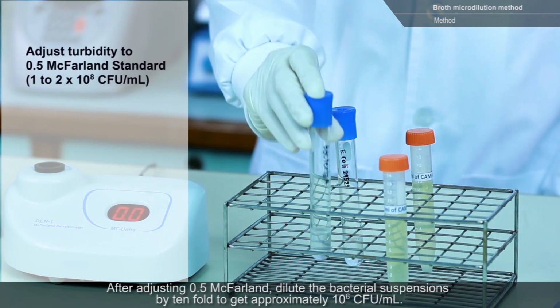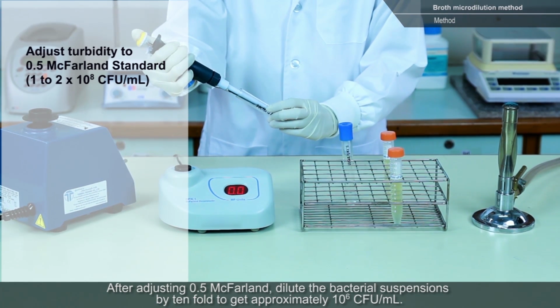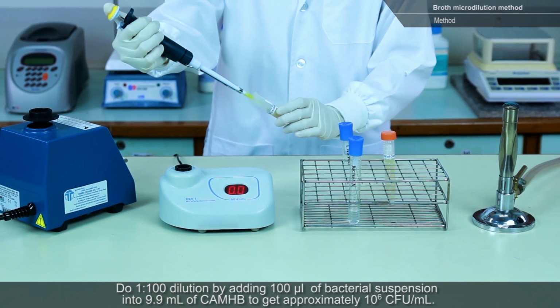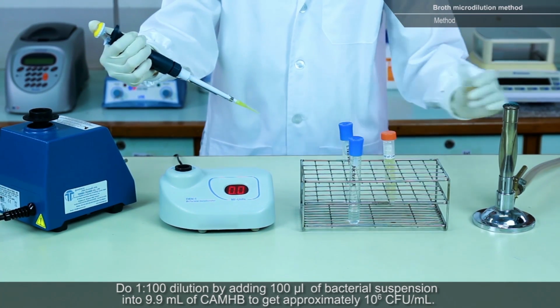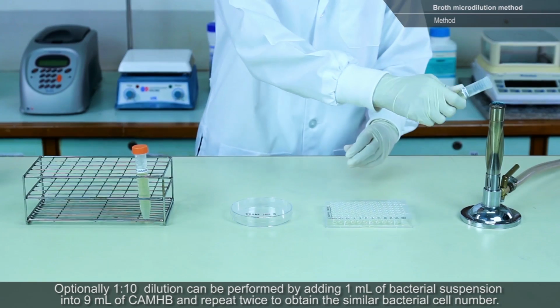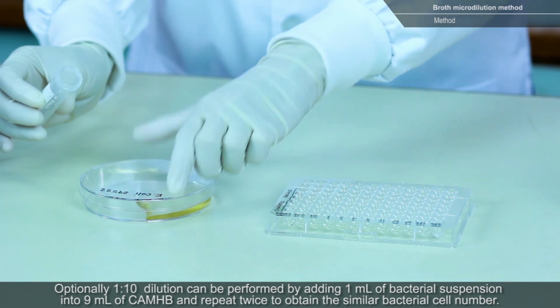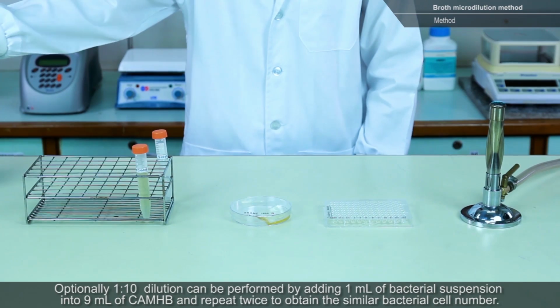After adjusting to 0.5 McFarland, dilute the bacterial suspension to get approximately 10 to the 6th colony-forming units per milliliter. Do a 1 to 100 dilution by adding 100 microliters of bacterial suspension into 9.9 milliliters of cation-adjusted MHB. Optionally, a 1 to 10 dilution can be performed by adding 1 milliliter of bacterial suspension into 9 milliliters of cation-adjusted MHB, and repeat twice to obtain a similar bacterial cell number.